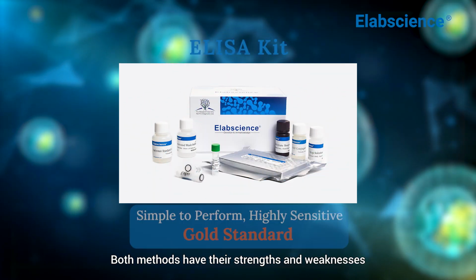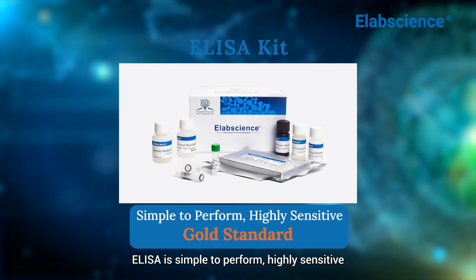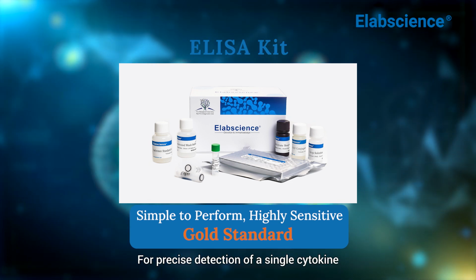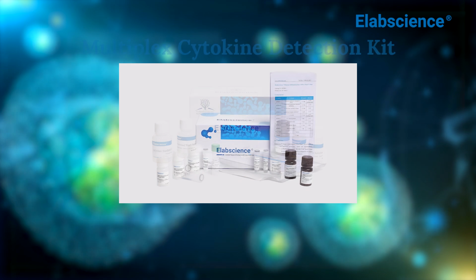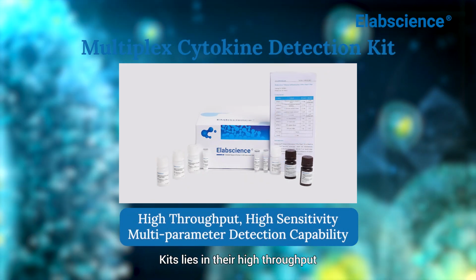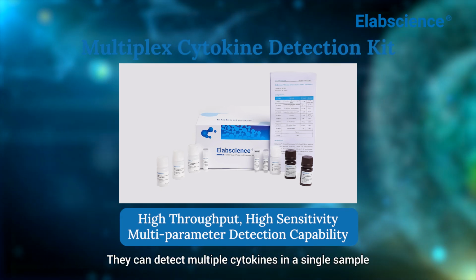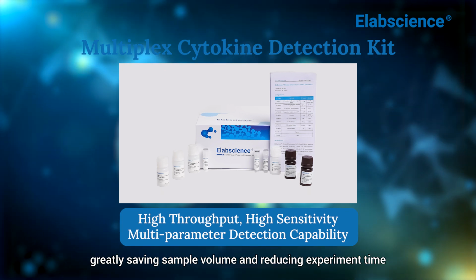Both methods have their strengths and weaknesses. ELISA is simple to perform, highly sensitive, and remains the gold standard for single cytokine quantification. For precise detection of a single cytokine, ELISA still has irreplaceable advantages. The core advantage of multiplex cytokine detection kits lies in their high throughput, high sensitivity, and multi-parameter detection capability. They can detect multiple cytokines in a single sample, greatly saving sample volume and reducing experiment time.